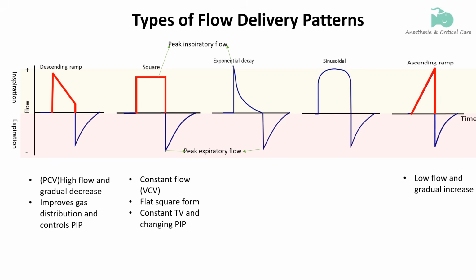The sine wave flow waveform gradually increases to a peak and then decreases smoothly, closely mimicking natural breathing and making it more comfortable for patients. It is used particularly during spontaneous breathing or pressure support ventilation.